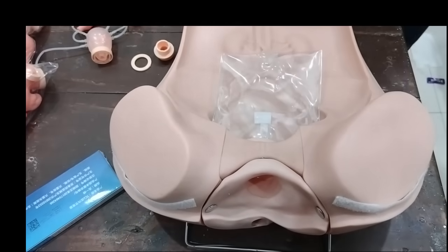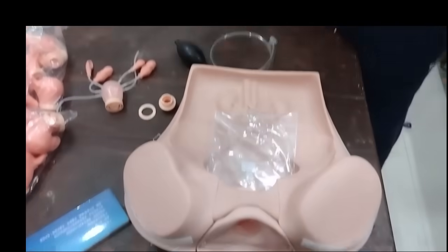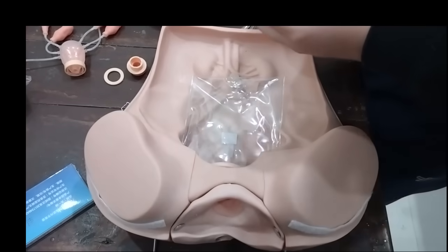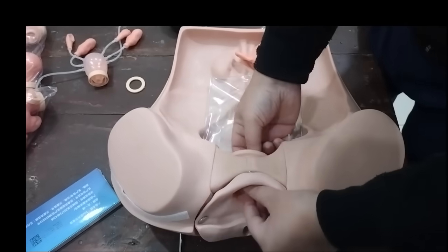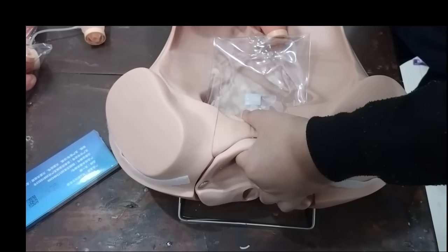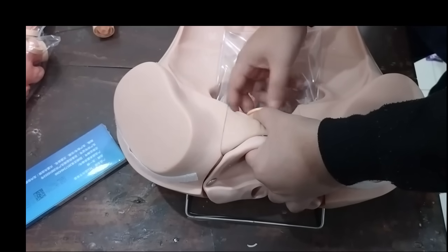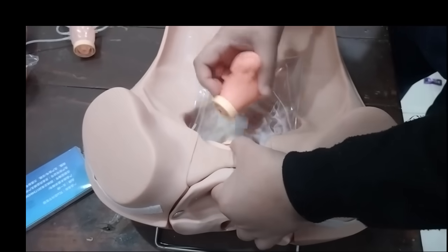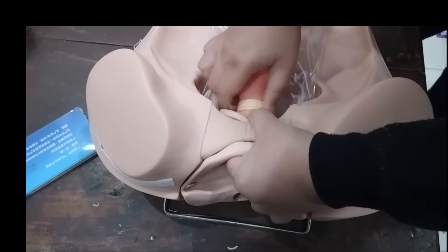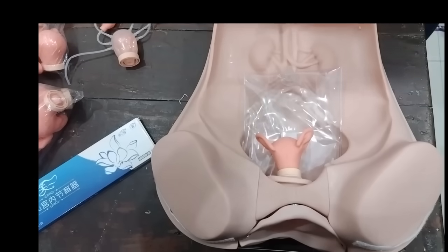Suppose I wish to attach a new uterus with this model. I am taking the number four uterus from the hysteroscopy kit. All I need to do is first insert the cervix, and once the cervix is attached, I just move it clockwise and the uterus is attached as well. Then I can put back the skin.